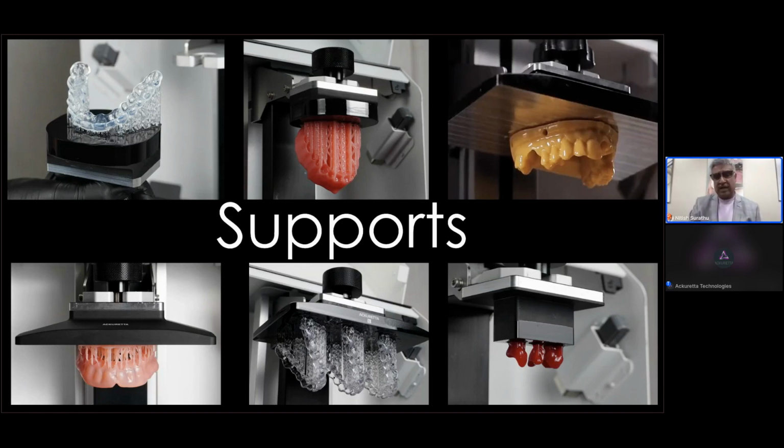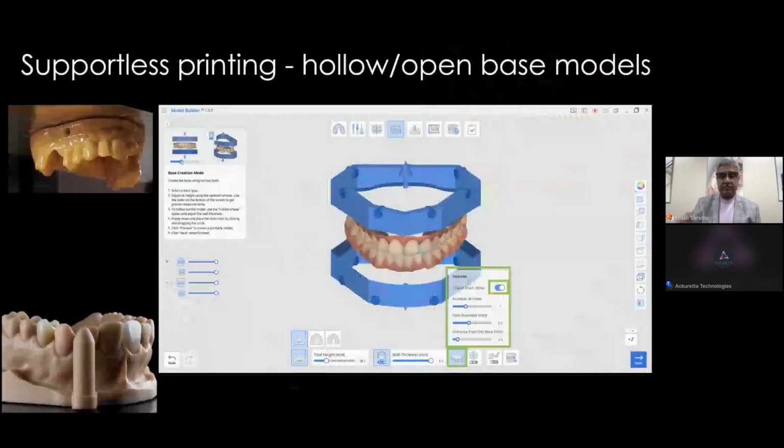If you're a novice user, I highly recommend though that you stay completely with supported printing and you work completely with Alpha AI Premium's auto-generated supports. That's what the software is designed for.